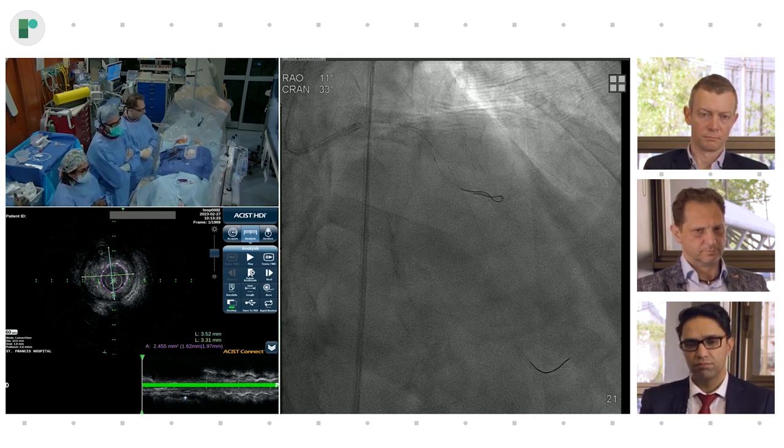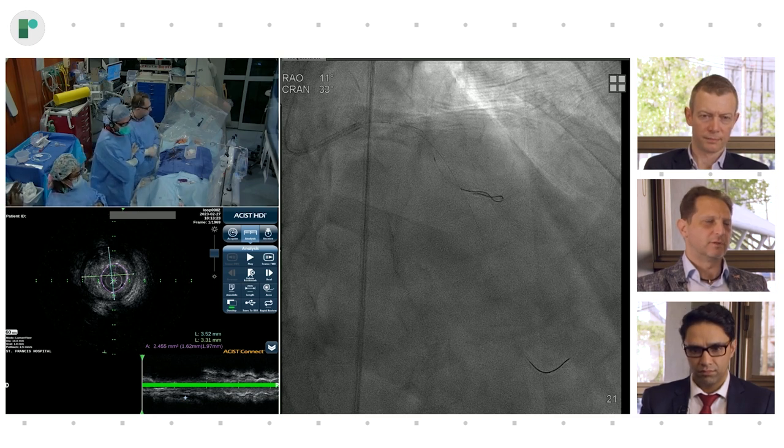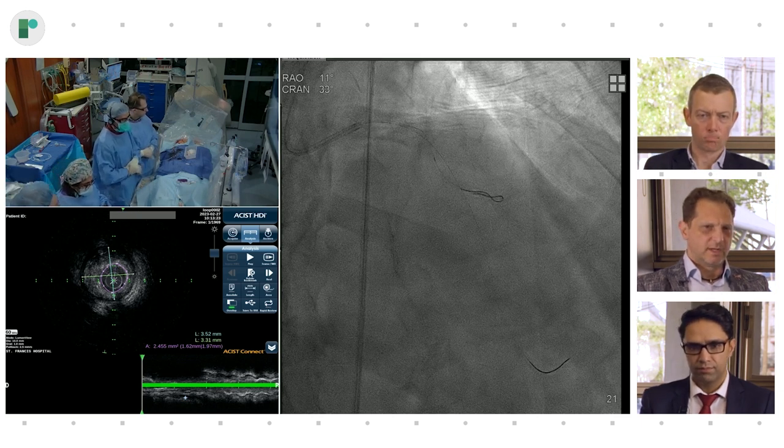My strategy here would be direct stent. So let's use a 2.5/40 stent, and then we'll get maybe a 3.0 and a 3.5 NC balloon. Perfect. Now, I think what Alan demonstrated was really very important, and that is, and then there's the discussion, right?